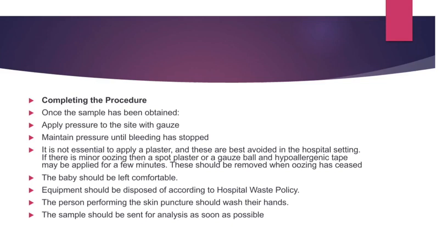The baby should be left comfortable. Equipment should be disposed of according to the hospital waste policy. The person performing the skin puncture should wash their hands. The sample should be sent for analysis as soon as possible.